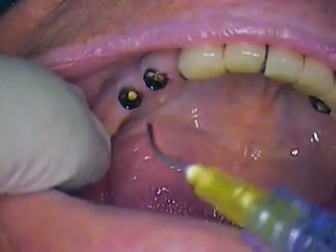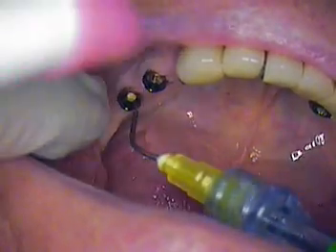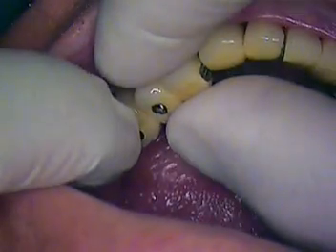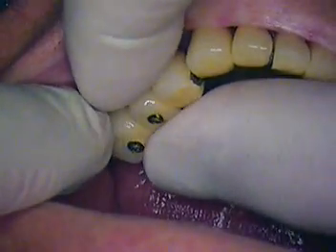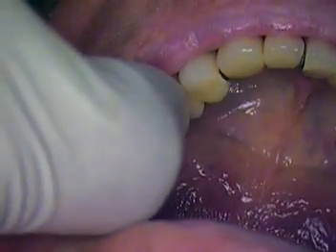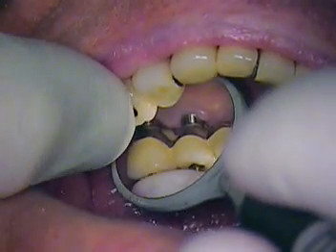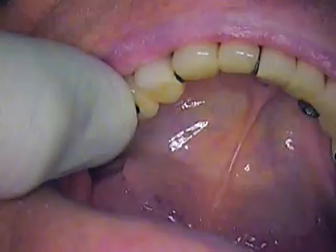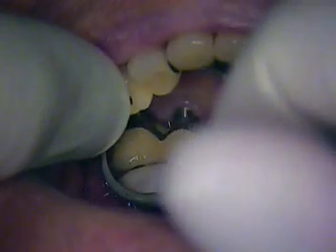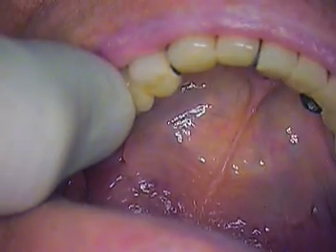We're going to dry them off. Already put the bridge in, and we'll get our screws ready to put them in as well. And that's how it goes in. And we can take a look underneath — notice that our fit is so much better now. We got a nice, even seat on both, and that's even without the screws. It looks like everything is going to go down perfectly.